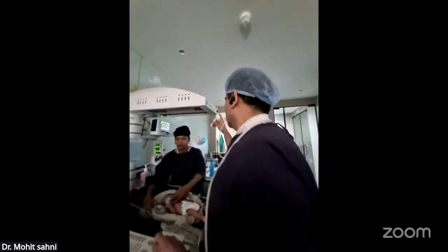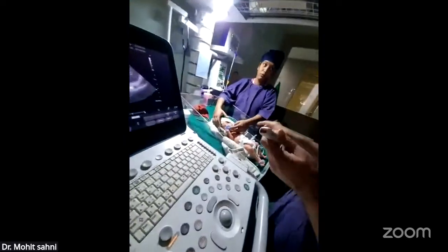And then when you sweep more lateral, that is periventricular, which I just showed you, in which we saw parietal lobe, occipital lobe, temporal lobe, and the sylvian fissure. That particular view is basically for the PVL, periventricular leukomalacia. So that is important. Now from the anterior fontanelle, we go to the temporal fontanelle. This is for the special views.